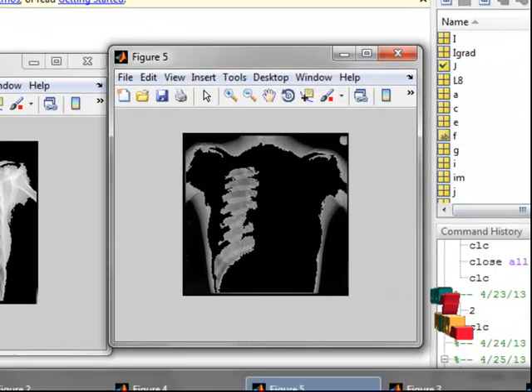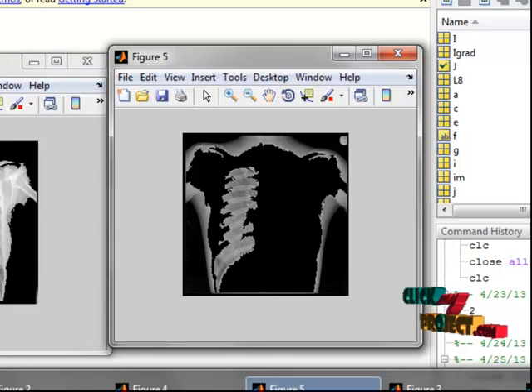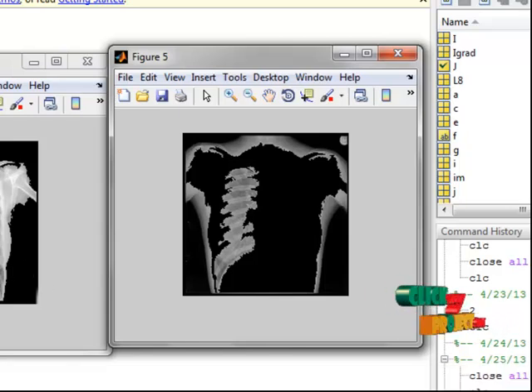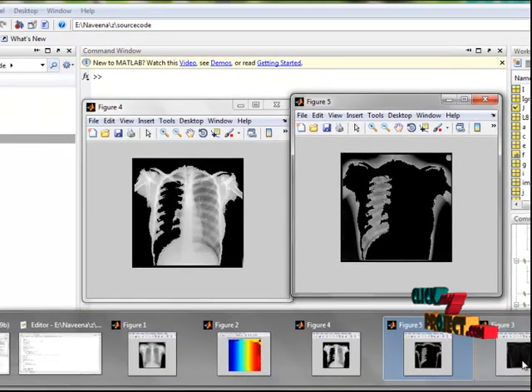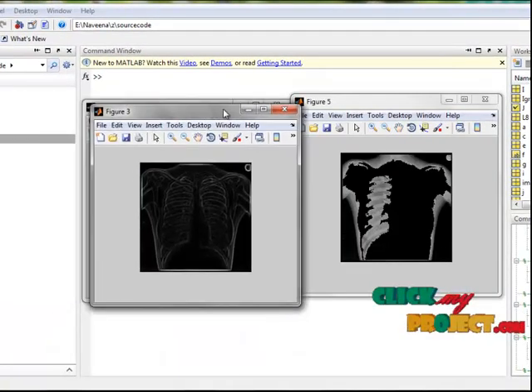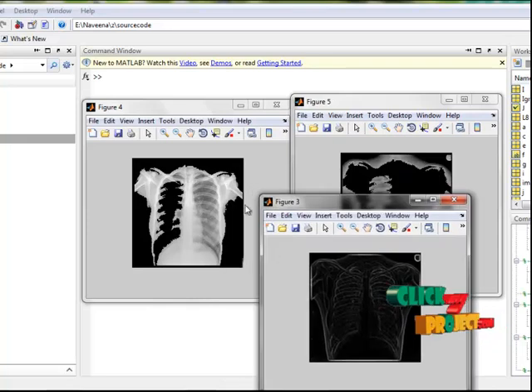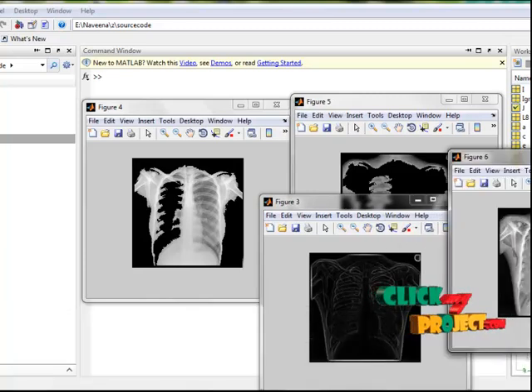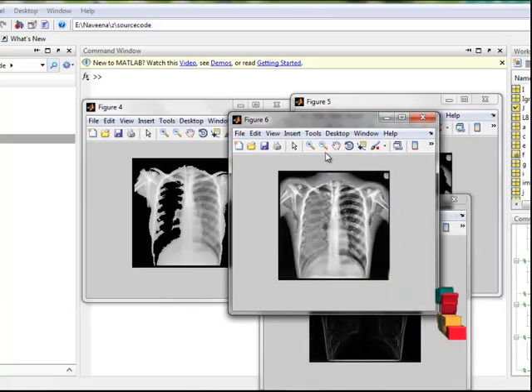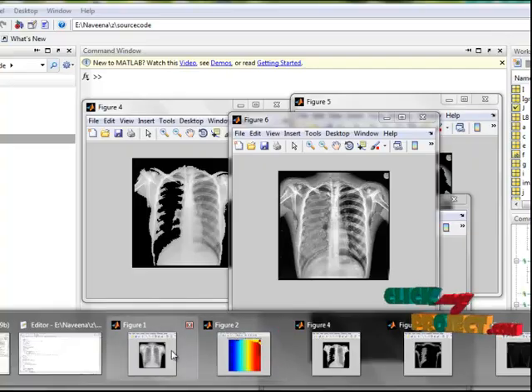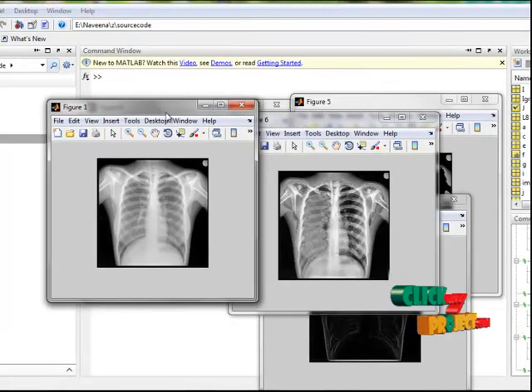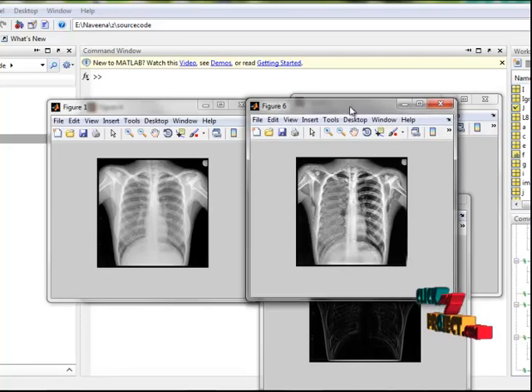Adaptive histogram equalization is applied to the foreground buffer, and then the original gradient value of the original image is added. These three are combined to form the final enhanced image. This is our original image and this is our final enhanced image.